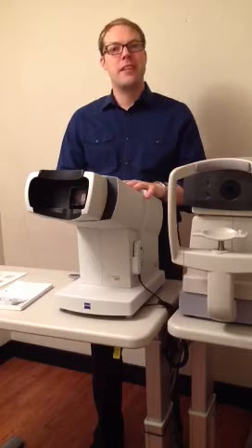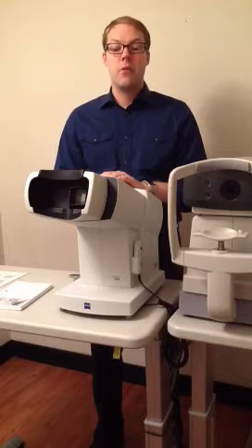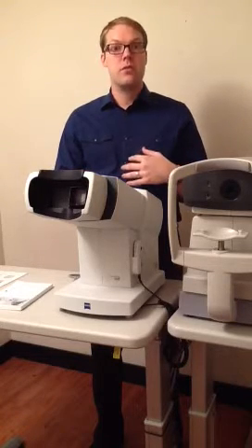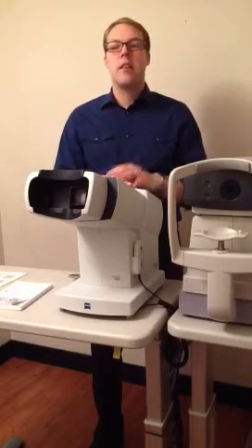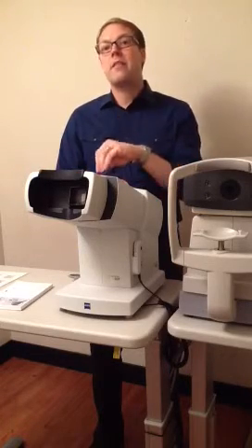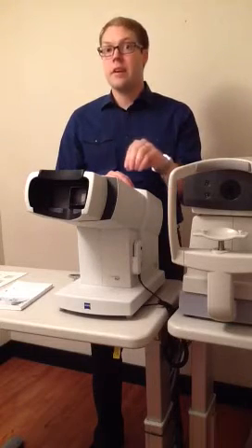This is the visual field test, and this is a test that Dr. Thompson wants you to have done today. And what this does is it checks for lots of different ocular diseases and disorders that can be hard to catch otherwise. Things like glaucoma, diabetic retinopathy, retinal detachment, and lots of others. And the important thing about this machine is that it can actually catch those things in the very early stages.